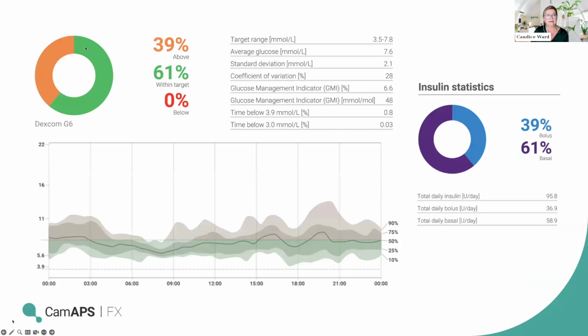So you can see the time in range here. She's 61% time in pregnancy range, so we're not quite getting there. There's no obvious hypo burden, but a sort of hyperglycemia burden. So you can see the AGP at the bottom. Sorry, I went too quickly.